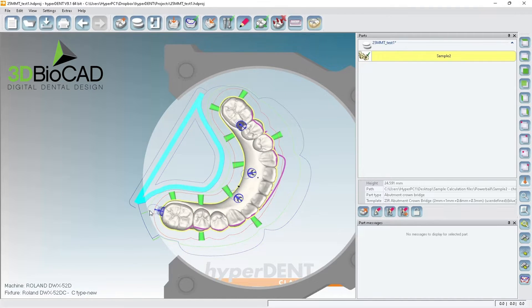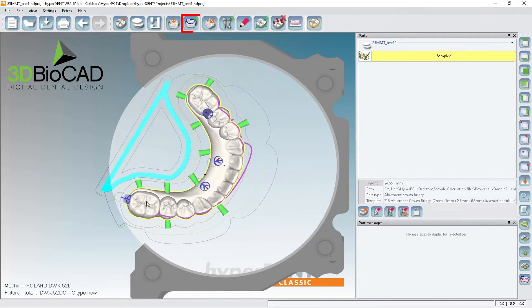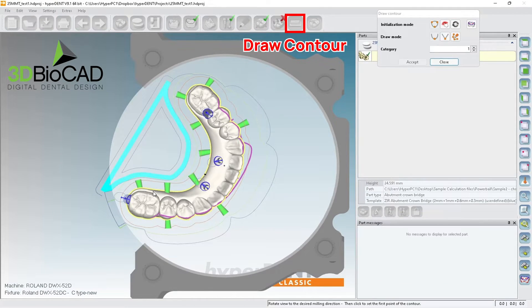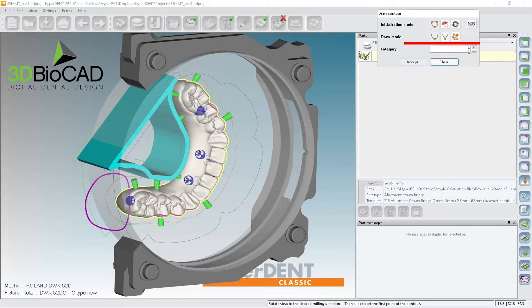When I'm milling like this, this stabilizer might be in the way. What you need to do is create another user-defined pass. I need to tell the computer to mill here, here, here — a bit more. If you're just making the boundary bigger, I have to make the category into two, but I forgot to change that.